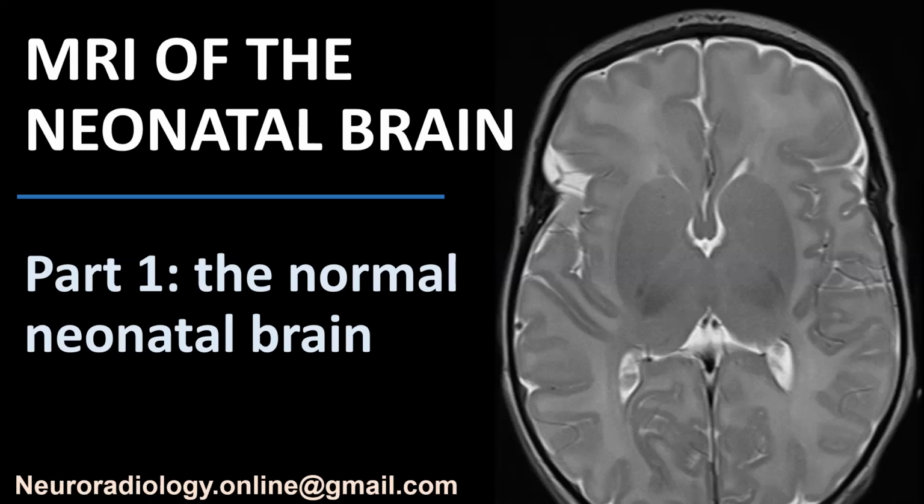Neonatal MRI is not performed that much, so a lot of radiologists do not have a lot of exposure to these kinds of MRIs. And they are only performed when the pediatrician or the obstetrician expects there to be something wrong in this newborn child. The patient might have a hypoxic ischemic encephalopathy, or there is suspicion of congenital cytomegalovirus infection, and so on and so on.